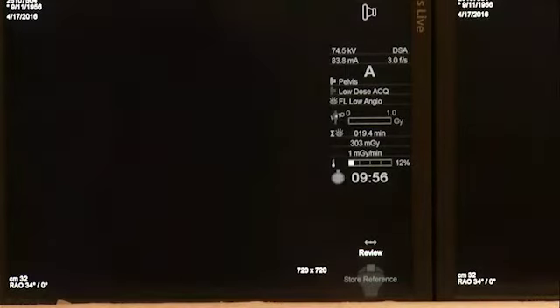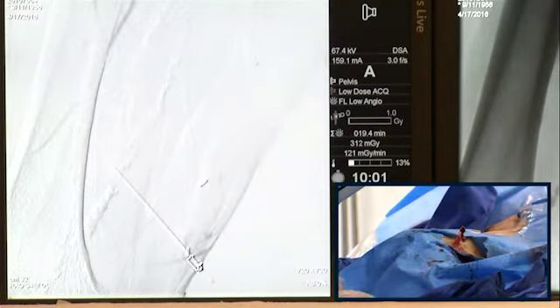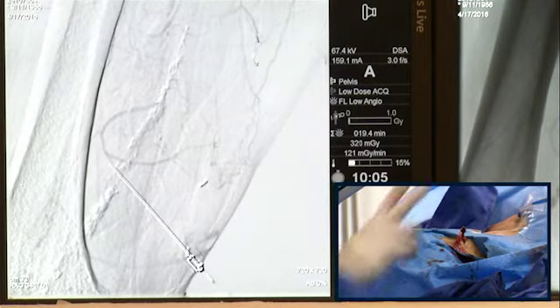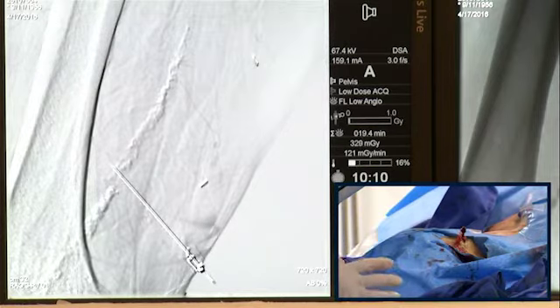So we can show this. This is actually a good teaching point. You can even see it by calcium, to be honest with you, but let us show it here. You see how the needle is past it. So what we're going to do is that, this must.